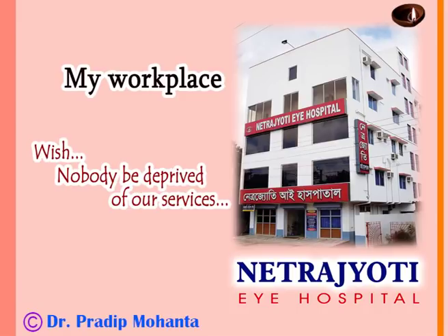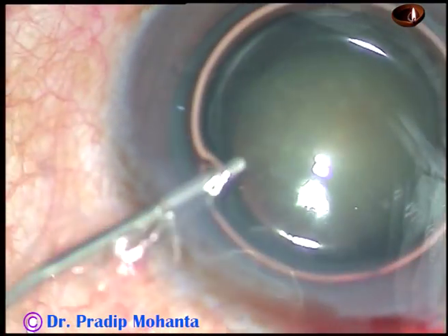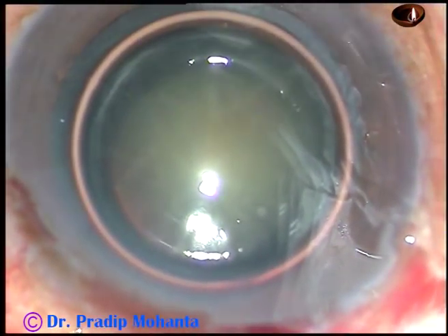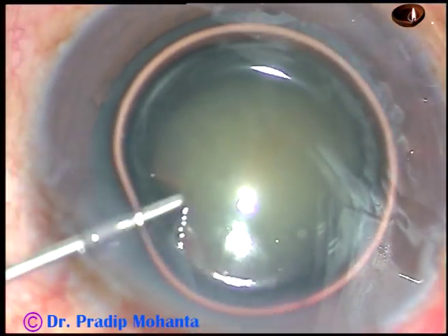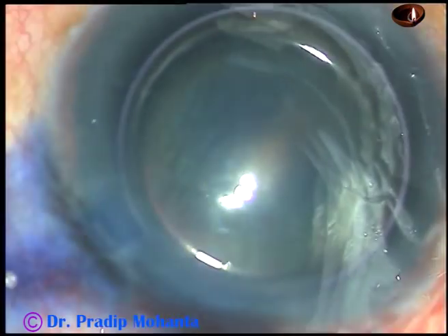Friends, welcome to my hospital at Rana Ghat, West Bengal, India. This is a cataract with grade 3 nuclear sclerosis. I think there was abnormal capsulocortical adhesion in this case because I could not do a nice hydrodissection.